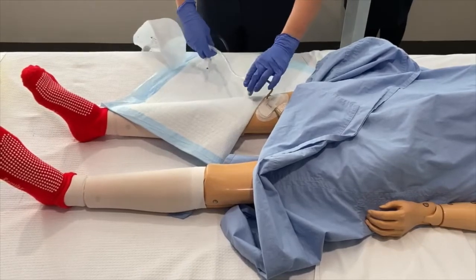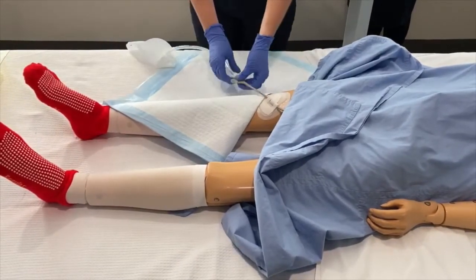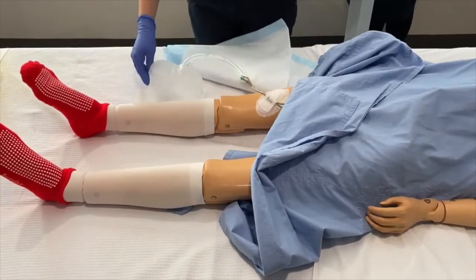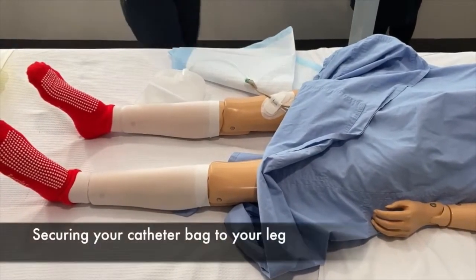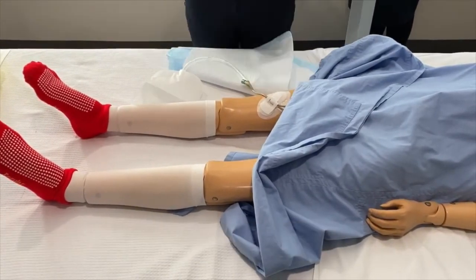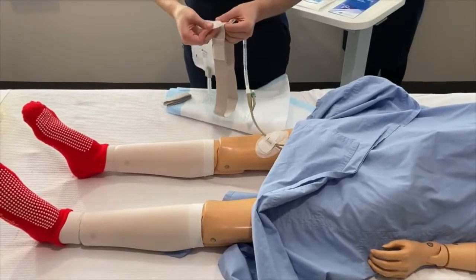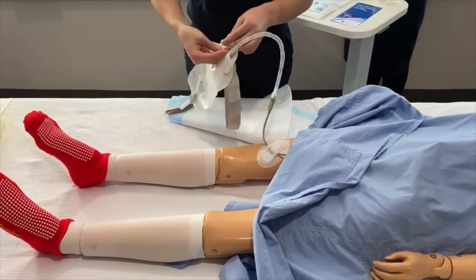We want you to feel comfortable in changing the catheter bag in the small chance there are any problems with the catheter. However, ideally this leg bag you have attached today should stay on until you have your follow-up appointment. Secure the catheter bag onto your leg. There will be two velcro straps. The bigger strap should be worn above the knee as shown, passing the buttons through the holes to help secure the catheter to your leg.